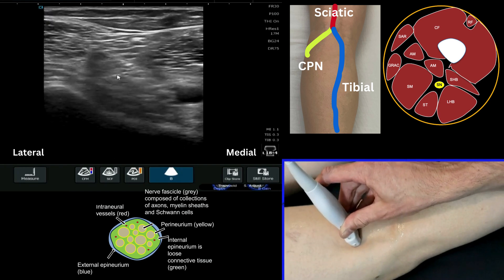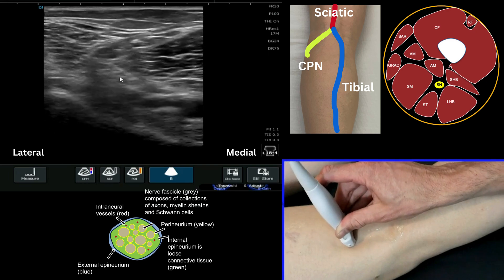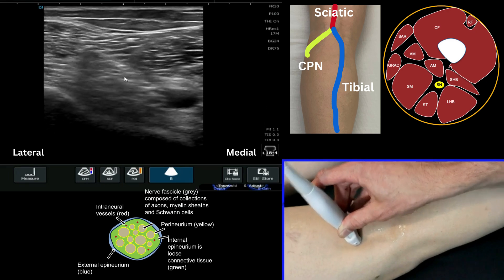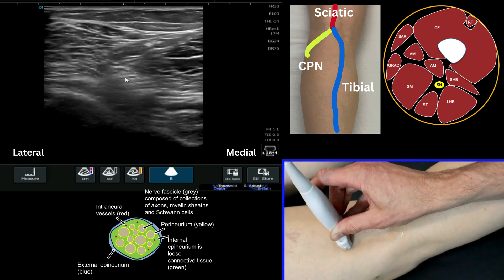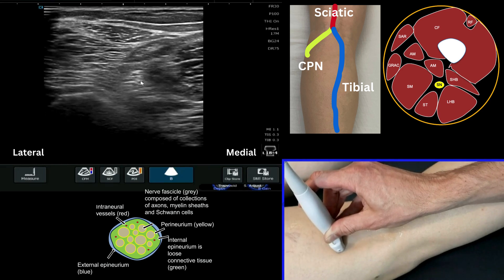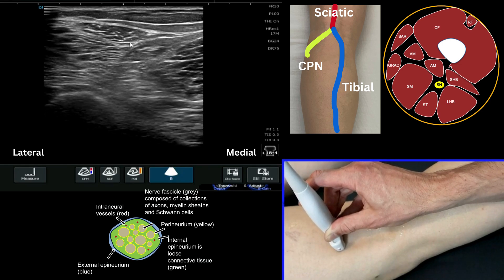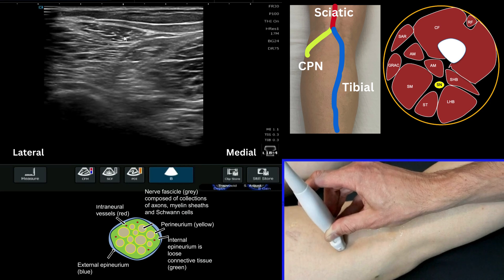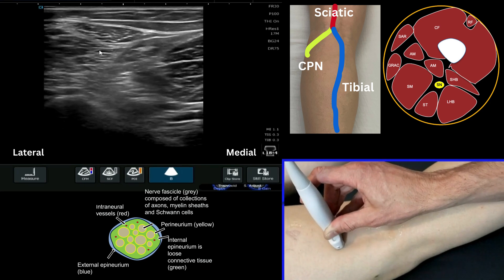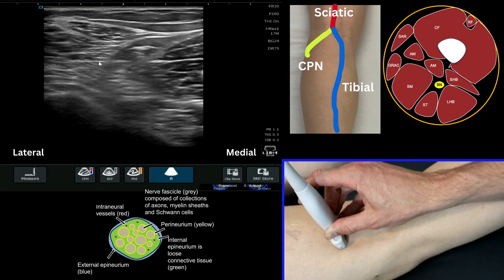This is quite difficult and you can see me tilting my probe to try and ensure that I can see this. The sciatic nerve, which is now visible here, sits underneath the long head of biceps femoris muscle — the lateral hamstring — which we can see starting to emerge here, along with the short head of biceps femoris.